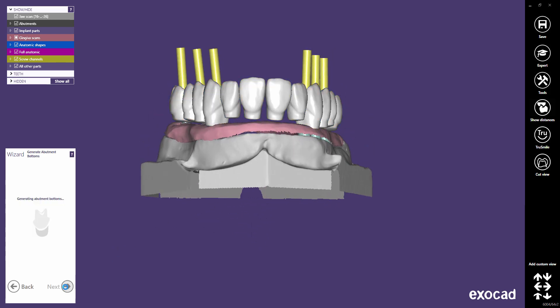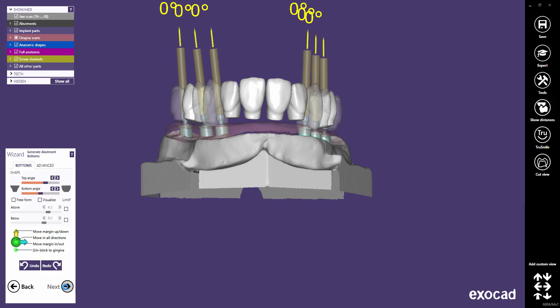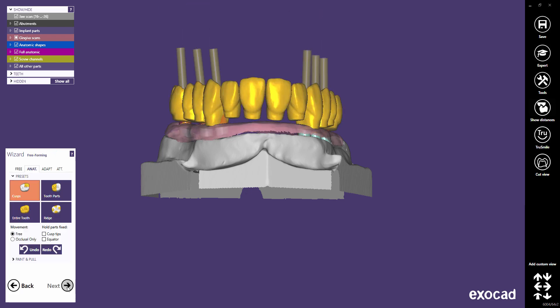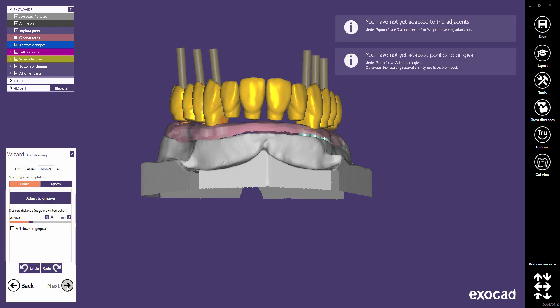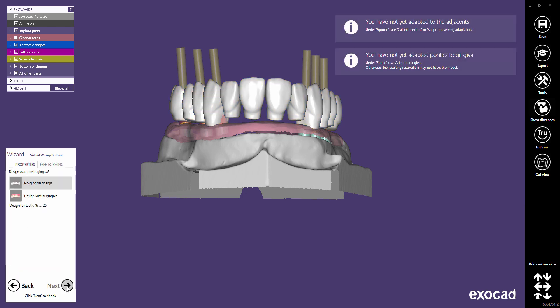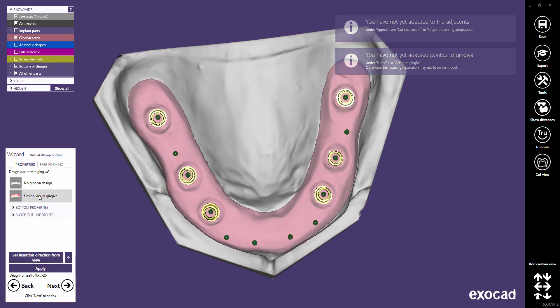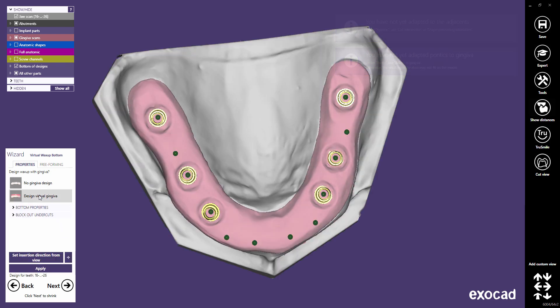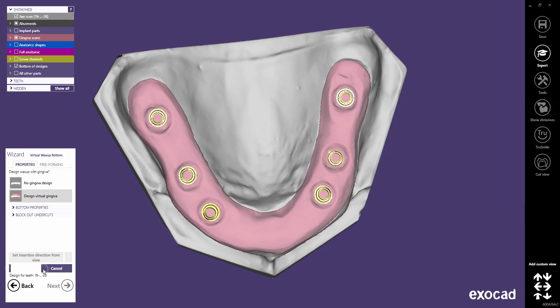Proceed to the next step. Let's skip the free-forming. Select Design Virtual Gingiva in the Virtual Wax-Up Bottom dialog. Click Apply to start blocking out the Virtual Gingiva's bottom. A separate video tutorial will explain the available settings in this dialog.